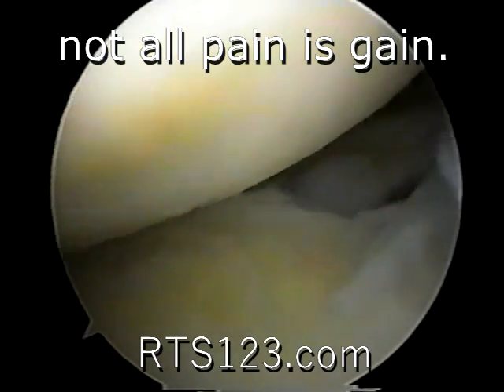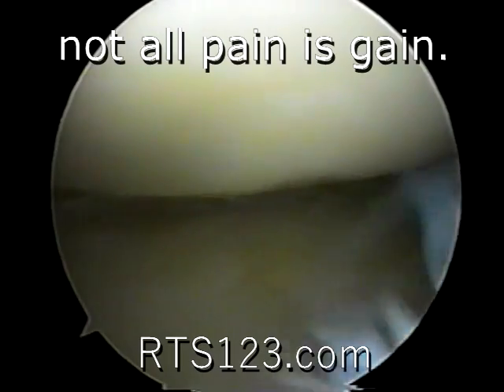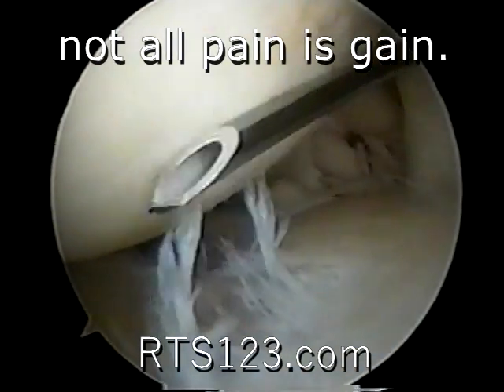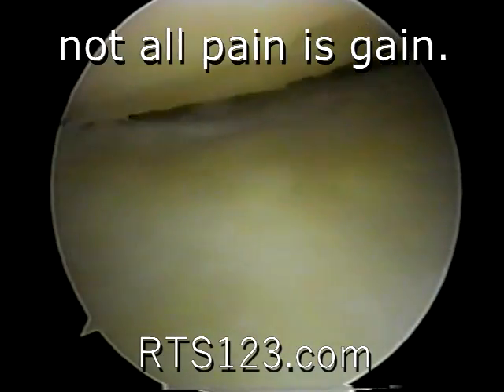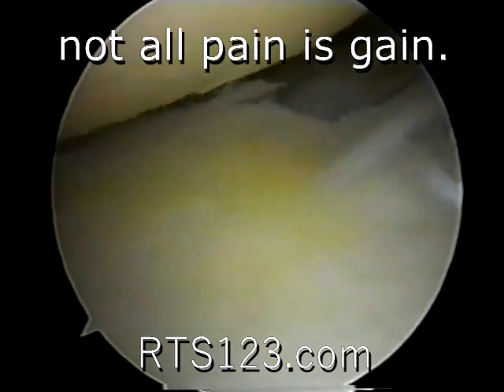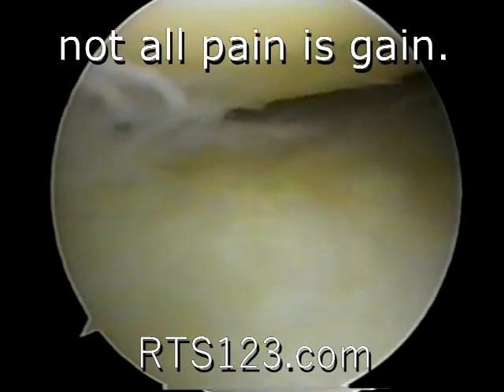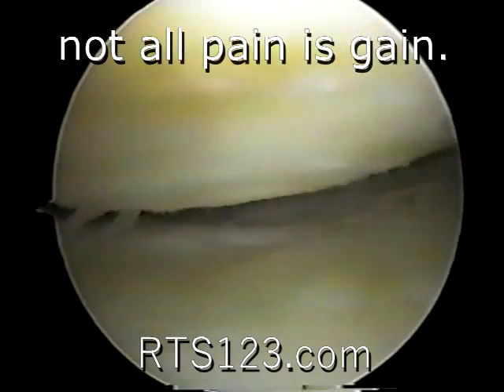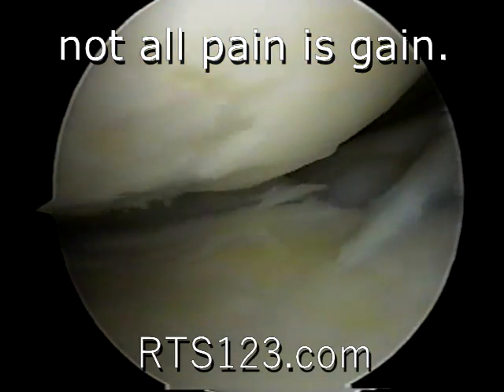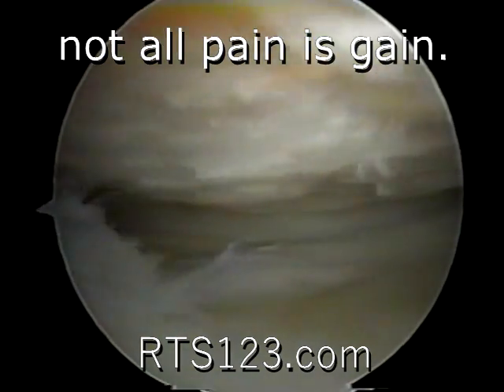One thing I want to show you here is you've got quite a bit of arthritis in this shoulder. A normal shoulder should be nice and smooth and pristine, sort of like this small area right here. And you can see down here the glenoid is very rough, very cobblestoney down in here. You can see the yellowish degeneration on the glenoid, how rough it is, and then look on the humeral head. See here as I rotate the humeral head, you've got a huge, huge area of arthritis there. As I spin your arm around, see it's down to bone right there.